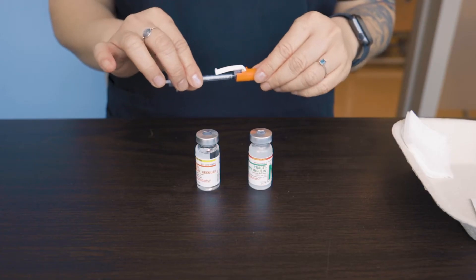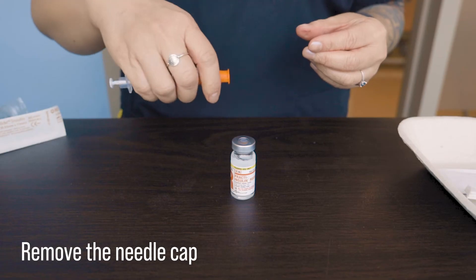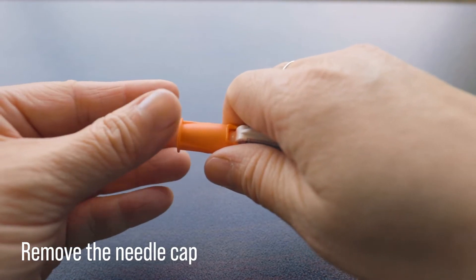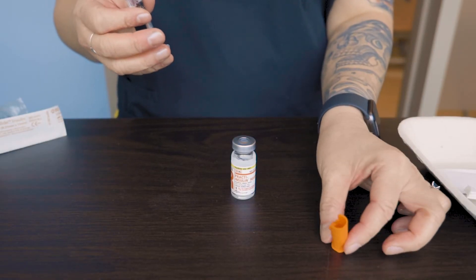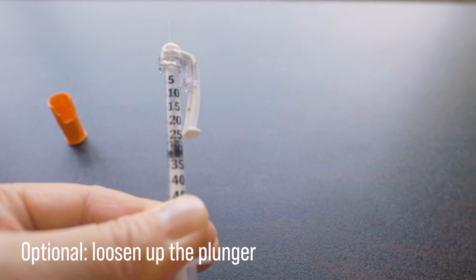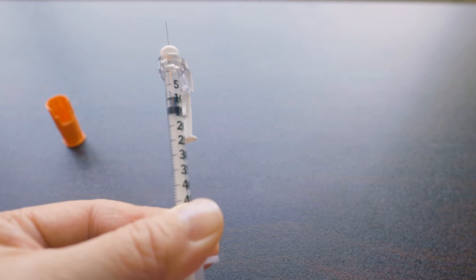We want to safely remove the needle cap. You can use two hands or one hand first to loosen it out. Set the cap upside down. I like to pull back on the plunger a couple of times to loosen up the rubber to make it easier to draw up the air and the medication. You don't have to do this, but I find it helpful.